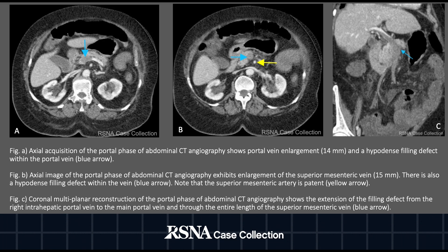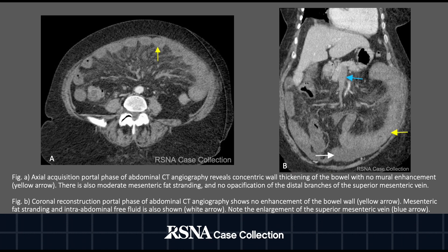Figure C is a coronal multiplanar reconstruction of the portal phase of the abdominal CTA, showing the extension of the filling defect from the right intra-hepatic portal vein through the main portal vein and through the entire length of the superior mesenteric vein, as shown with the blue arrow.